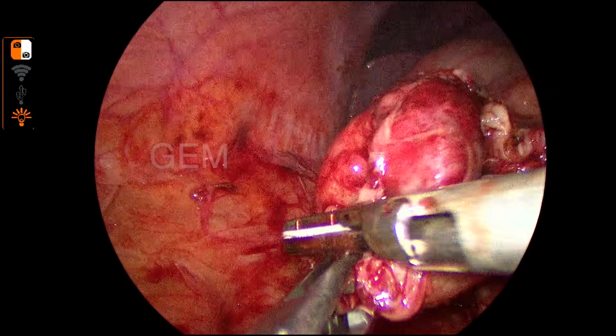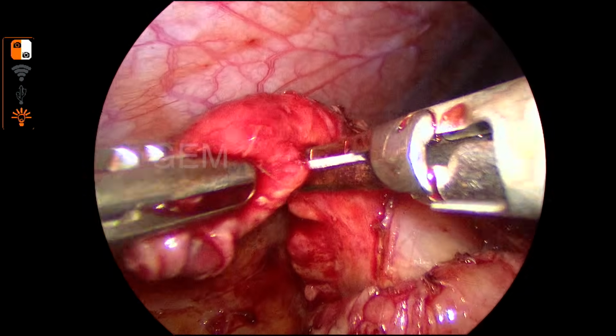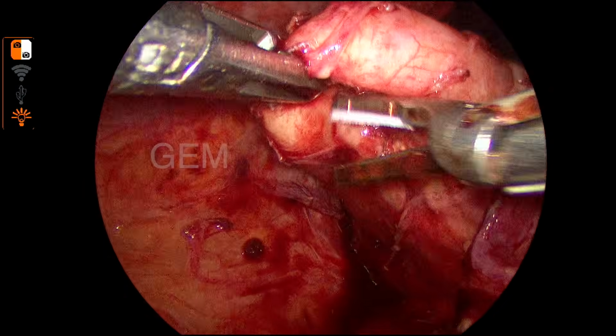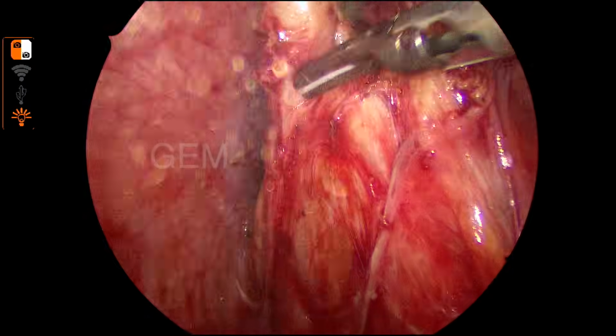That area is close to the cecum. See, the appendix is coiling, turning, and then adherent to the cecum. So that is the tip. So I am starting again, division of the mesoappendix close to the appendix.